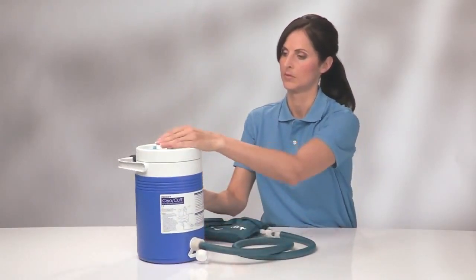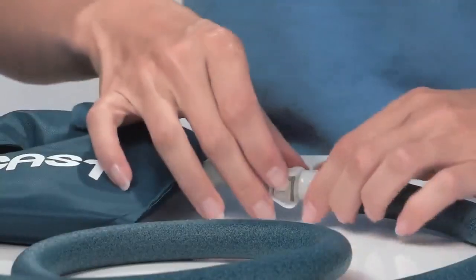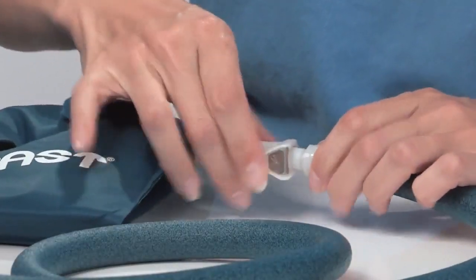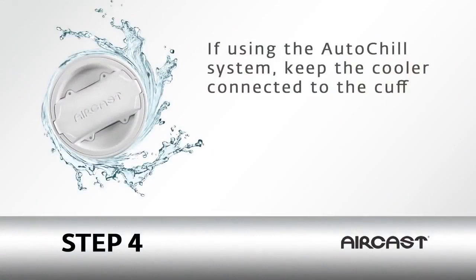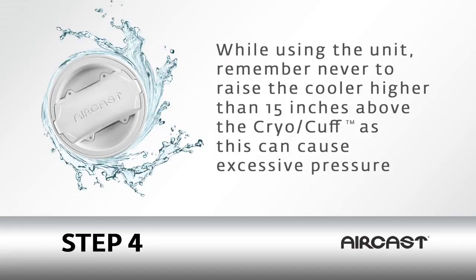Now, close the air vent on the cooler lid and disconnect the cooler from the cuff by pressing the metal tab on the quick disconnect while the cooler is raised. If using the auto-chill system, keep the cooler connected to the cuff. While using the unit, never raise the cooler higher than 15 inches above the cryo-cuff, as this can cause excessive pressure.